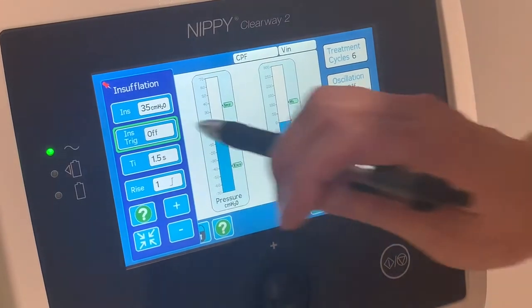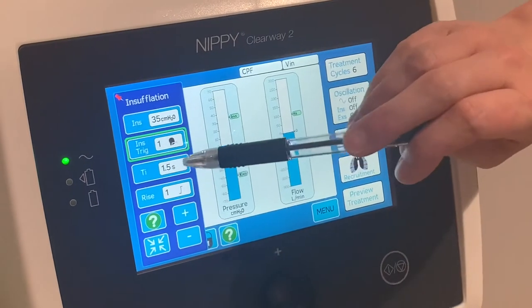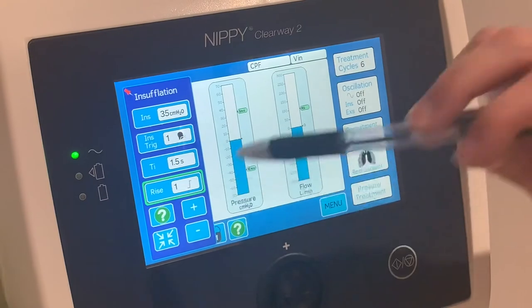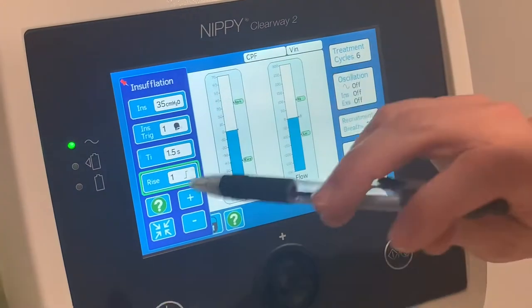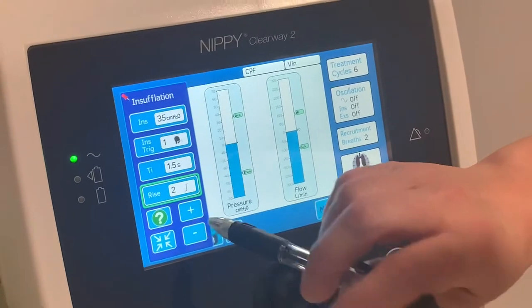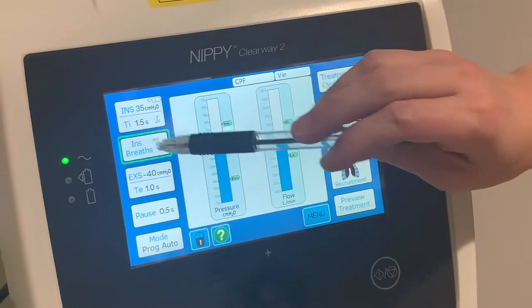With the inspiratory trigger off, it works similarly to the old Clearway — that's timed auto. With the trigger on, it's triggered auto. You then have your timed inspiration and your rise time, which is how quickly it takes to reach the plus 35 pressure. You can adjust the rise time up to 5.